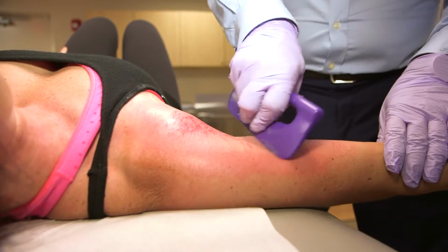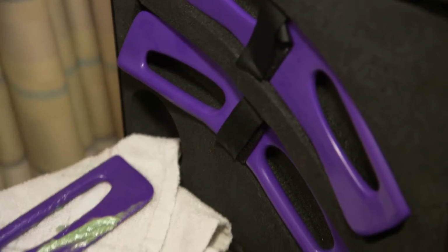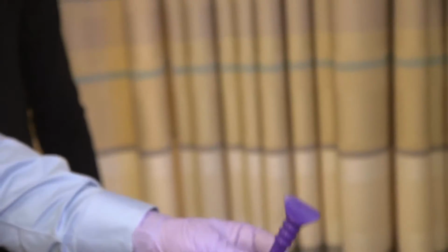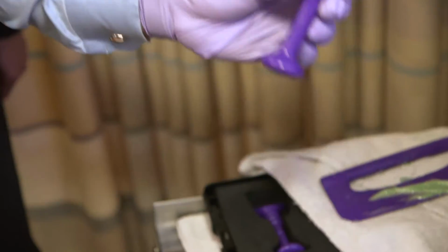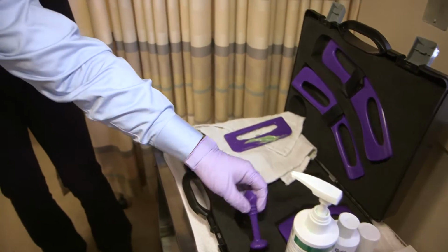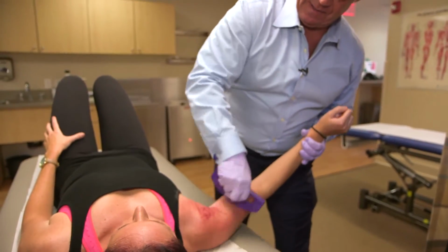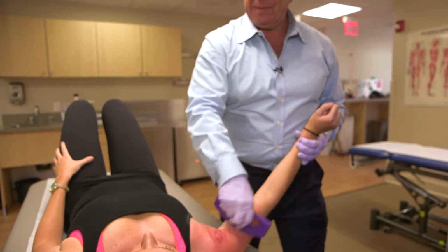We now have different size tools. Some start from this size here, which we use for smaller muscle groups and tendons. Some are as little as these, which we use for hands and feet. And this is a real little guy right here. All right. I've gotten much faster with this over the years. It now only takes me a few minutes to do the body part.